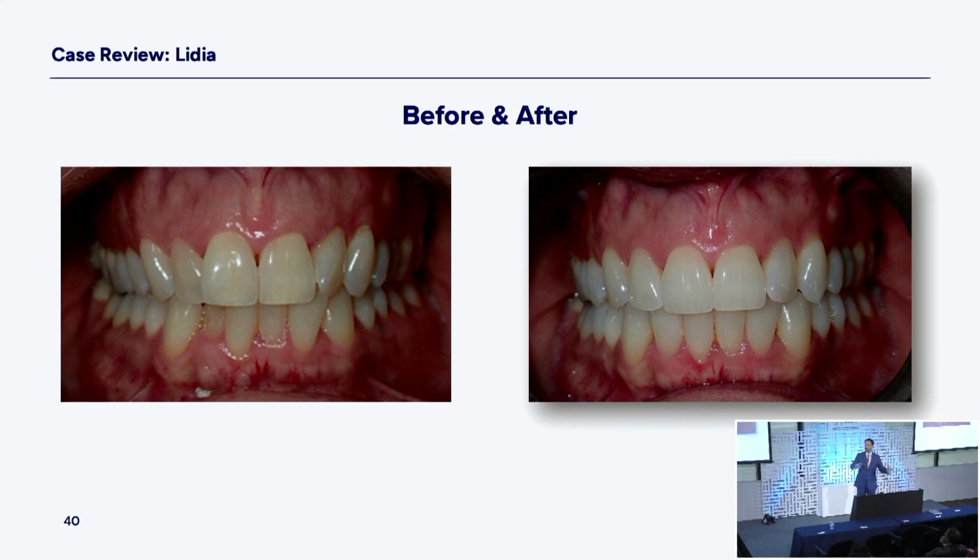Let's say this is a 12-month case. Because of the monitoring, we don't recall the patient to the office to check. When they come in, it's just on their recall visit. The only time we see the patient is in the hygiene chair. When they're due to come in on their hygiene visit, we take a peek. How you doing? We know the monitoring's going because we're going to see tomorrow it gets put in the portal. And we know they're tracking perfectly along the way, and maybe number 7 they wore an extra week. Oh, number 9 they wore. We see it all. So we know we're going beautifully.